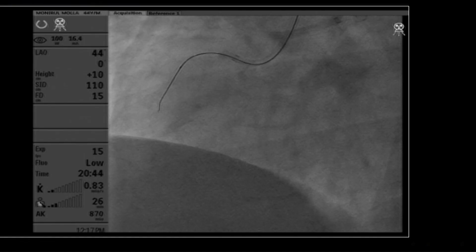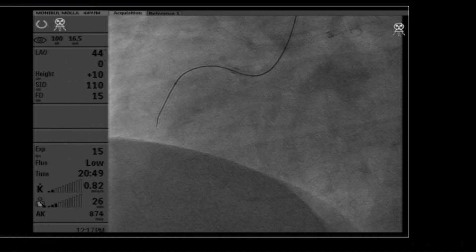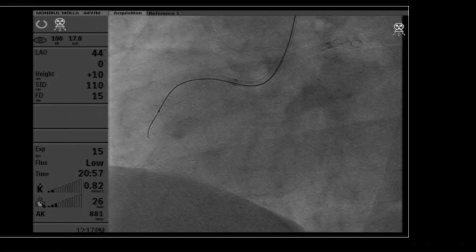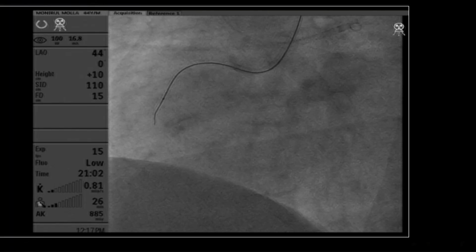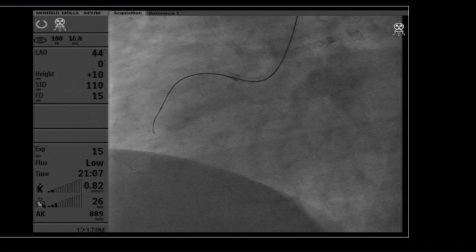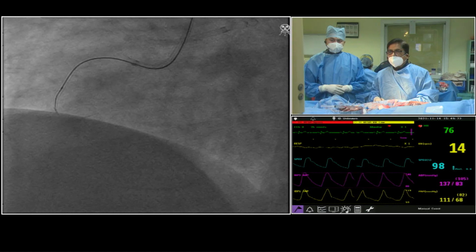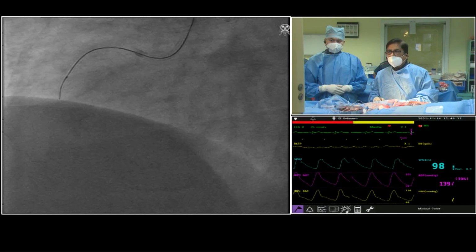Pratap, any specific choices of microcatheters that you would prefer? FineCross is usually the choice for most of us. If there is a difficult situation like this, I usually take FineCross only. Corsair Pro is also very good, but in this case Caravel is definitely not a good choice. That's very important. Caravel is a good choice only in septal channel crossing, not for this type of lesion crossing, where either a FineCross or a Turnpike Spiral is very good, which is not available in our place. And the third option is Corsair Pro XS.